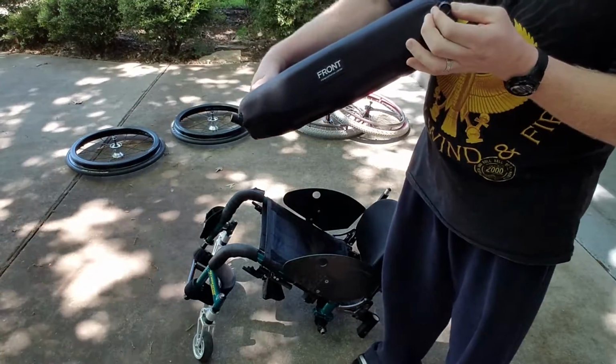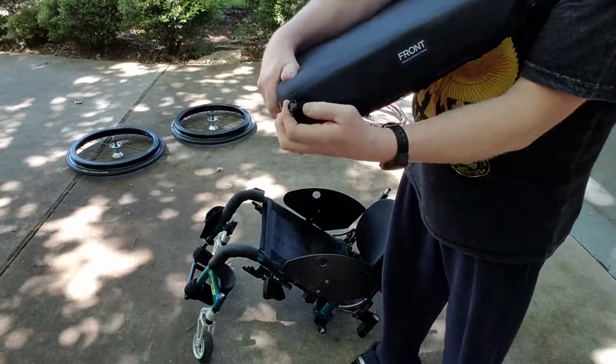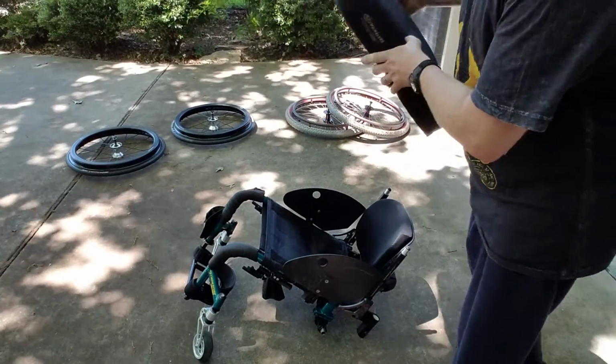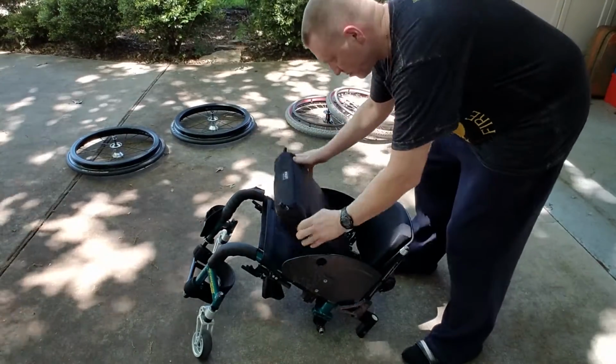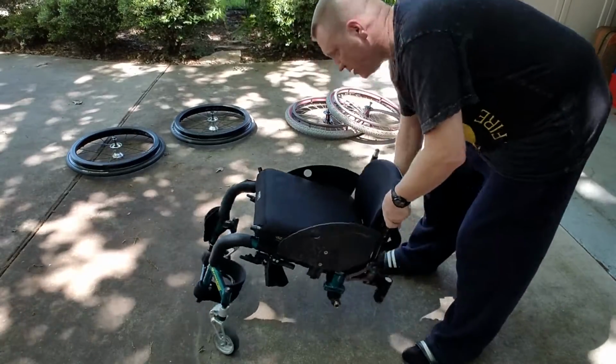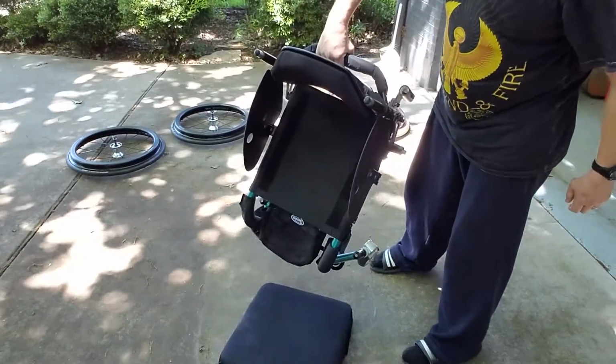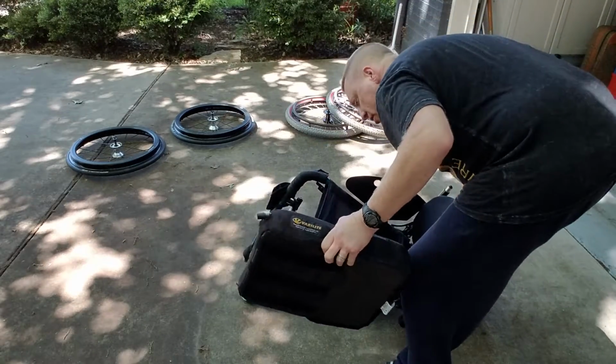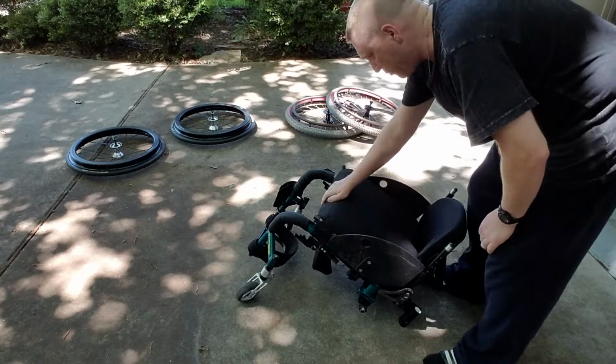The seat cushion has knobs here where you can adjust, inflate or deflate the amount of cushion to your comfort, but it just sits in there like that. So I mean, if you were to tilt it forward, it'll fall out. Just something to bear in mind when you're transporting the chair, because a lot of times this will just slip out real easy.